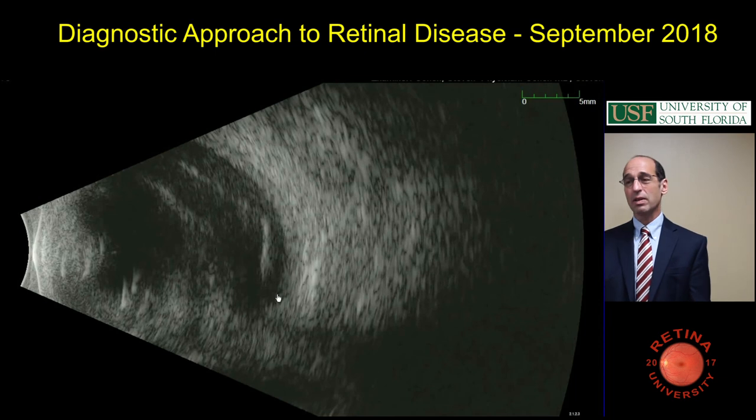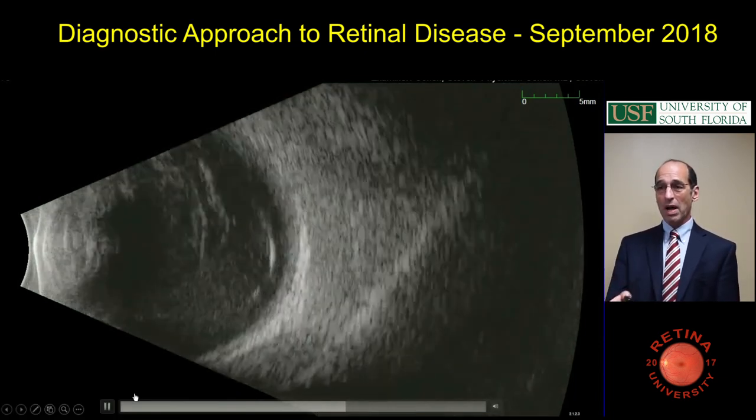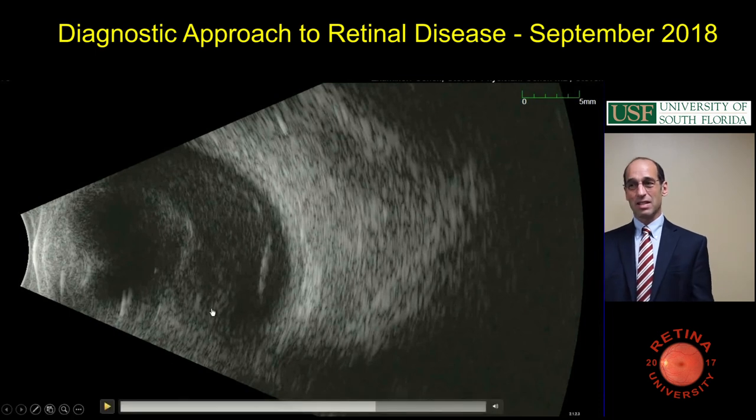So for contrast, that's not a retinal detachment. She had a hand motion vitreous hemorrhage. I couldn't see anything, but I watched her for 3 months, and I just operated on her 2 days ago. The retina was moved, but it wasn't detached. And then this is a detachment.